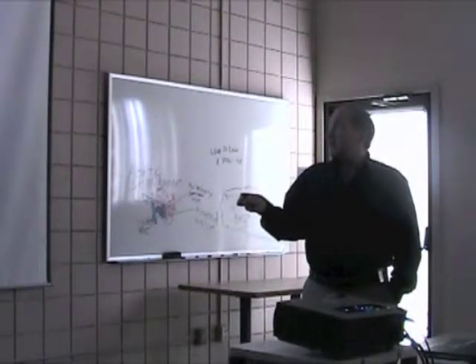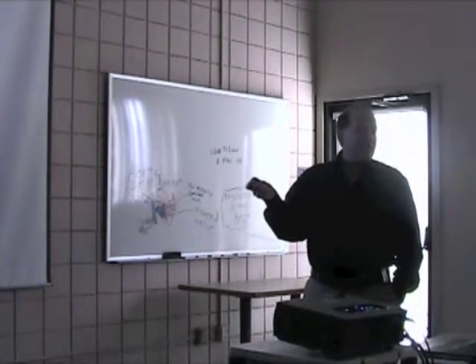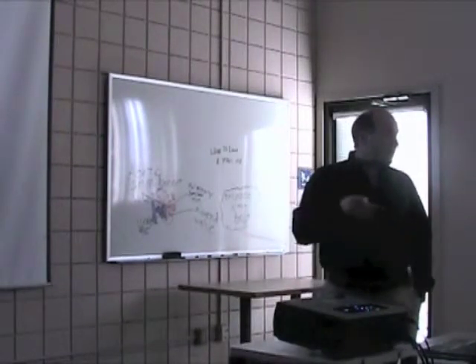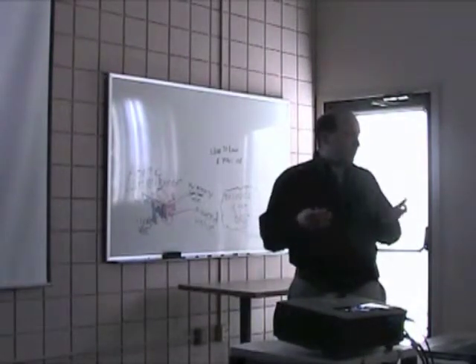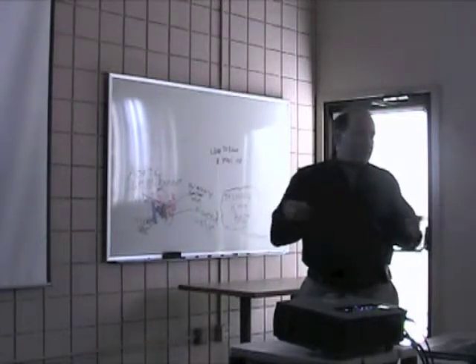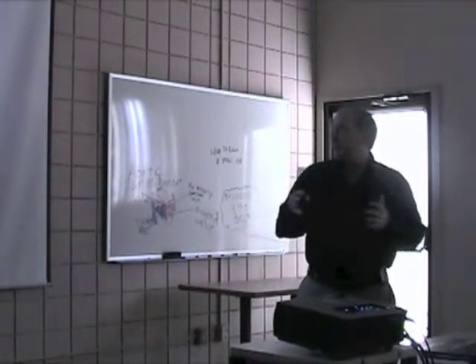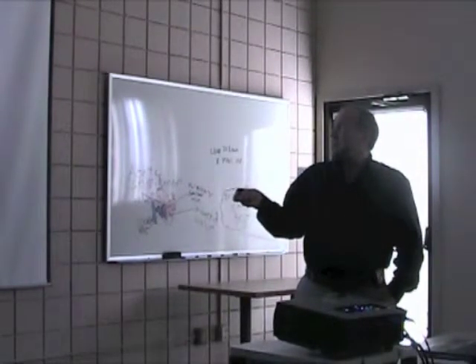Patient age has something to do with it. In kids, we oftentimes don't put a pig valve in. Because if you have a 12-year-old and you put a pig valve in and the rest of them grows, you're going to need to do a reoperation and put a bigger valve in. So in kids, sometimes we use mechanical valves because they tend to last longer. But it really varies. There are technical aspects in some patients.